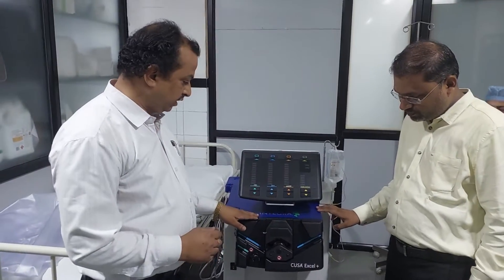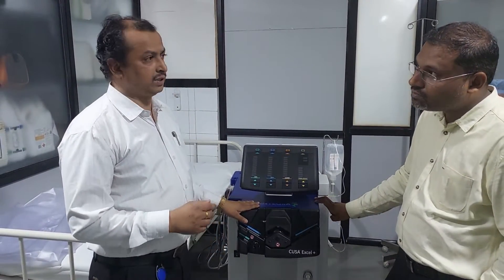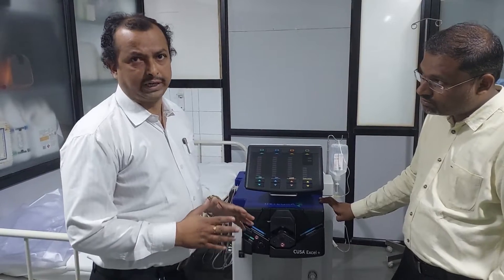CUSA is invented by Integra Company. This is the first company who invented the CUSA machine, and others have followed this technology.